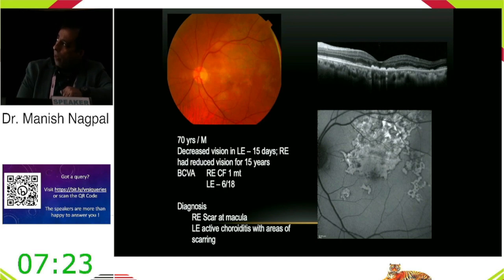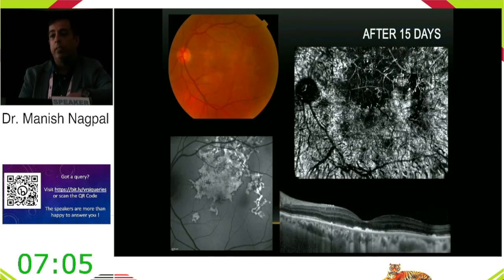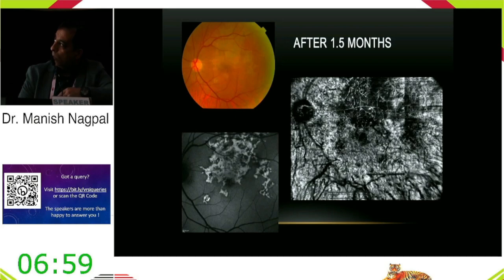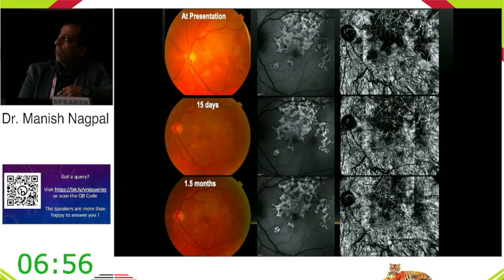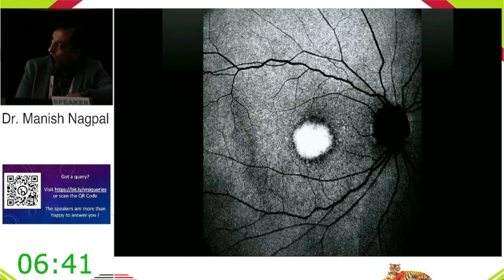The other areas of activity that you can deal with by multimodal imaging is also to look by OCTA. You saw the neovascular capabilities, but also for these posterior uveitis entities, you can see active lesions as these hypofluorescent dots, just like you see in ICG, the same thing you tend to see on OCTA as well. Using these modalities to look at an active lesion, and as you treat this lesion, from the top to the bottom, you'll see that the lesions are coalescing and then dispersing. So the activity goes down as you treat the patient with high dose steroids and follow them up over a period of time.